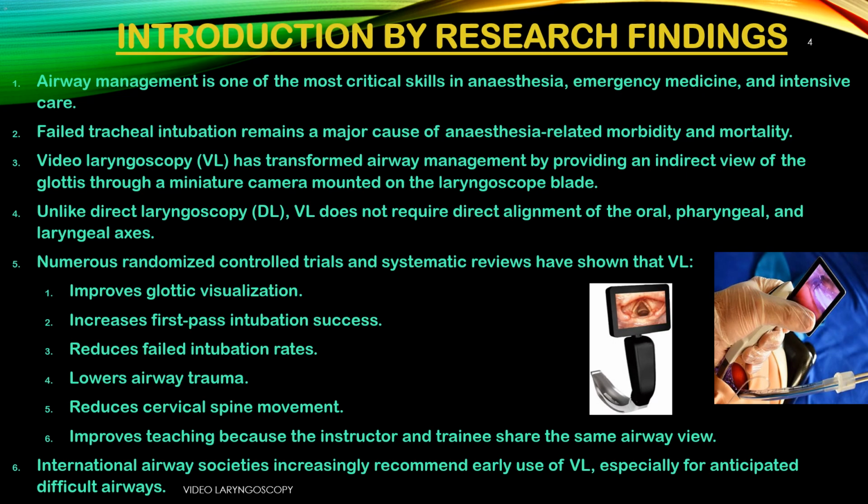1. Airway management is one of the most critical skills in anesthesia, emergency medicine, and intensive care. Master the airway. Master the patient. 2. Failed tracheal intubation remains a major cause of anesthesia morbidity and mortality. One missed airway can change everything.